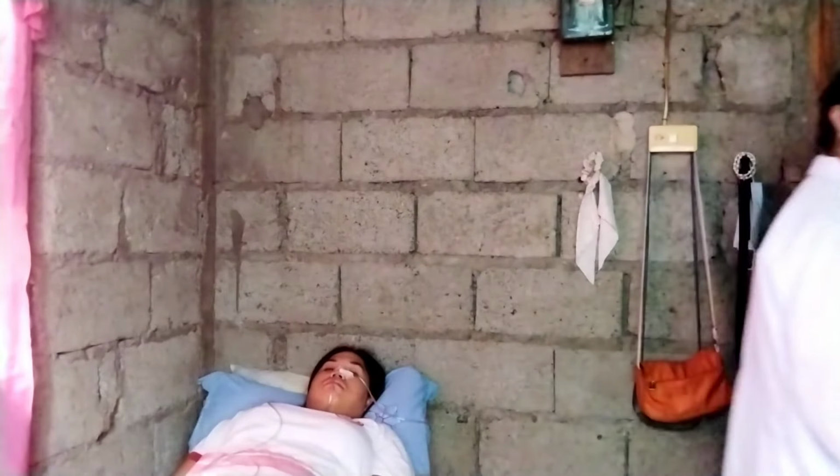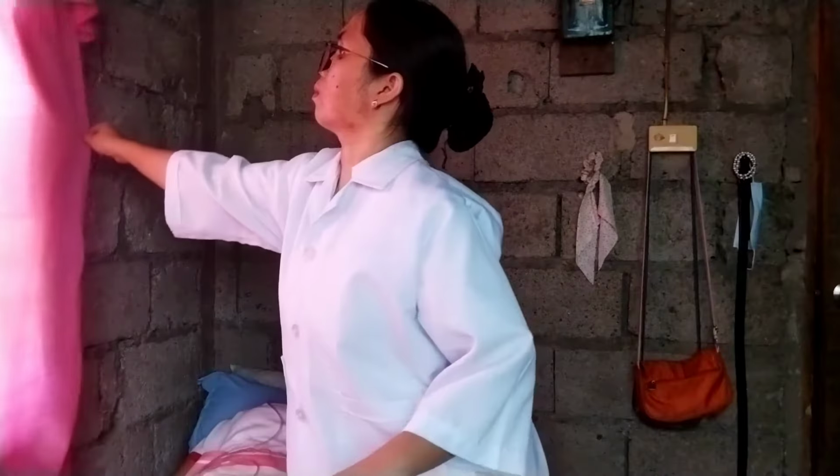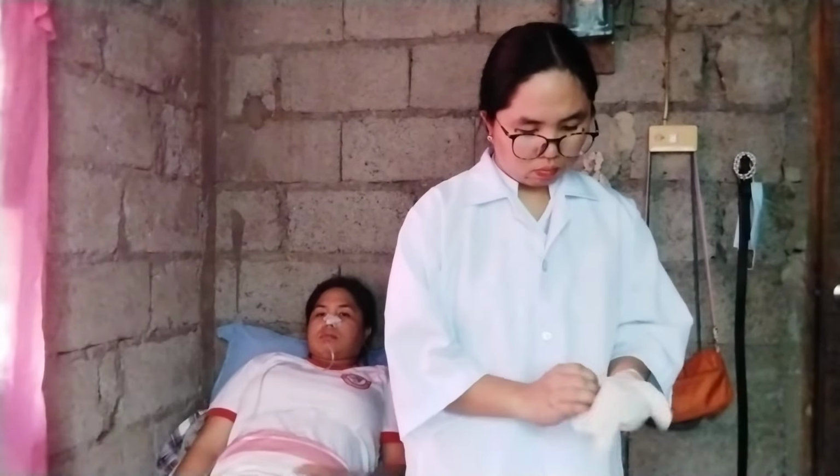Next, perform hand hygiene and observe appropriate infection control procedures. Then provide privacy for this procedure if the client desires it. Tube feedings are embarrassing to some people. Assess tube placement. Apply clean gloves.